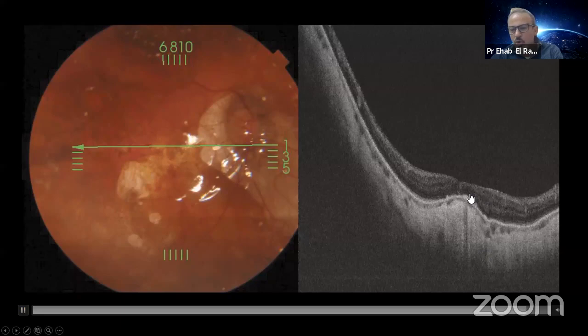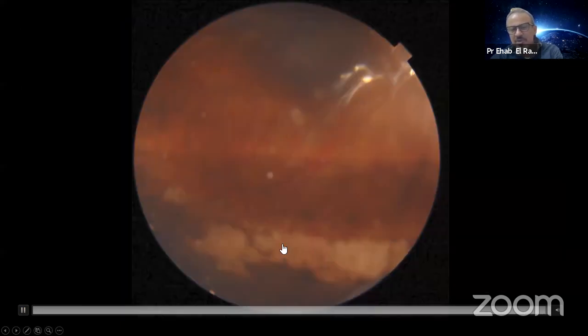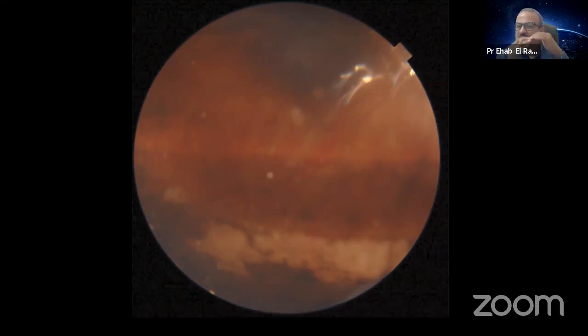What happened? The hole did close, but the amniotic membrane did get dislodged and it's floating in the inferior air bubble right there inferior. So they could act as patch, just give time to the hole until the edges flatten up in place and stay there. So it's just causing the dehydration. But I don't think it shares anything in the healing process that happens inside the eye.